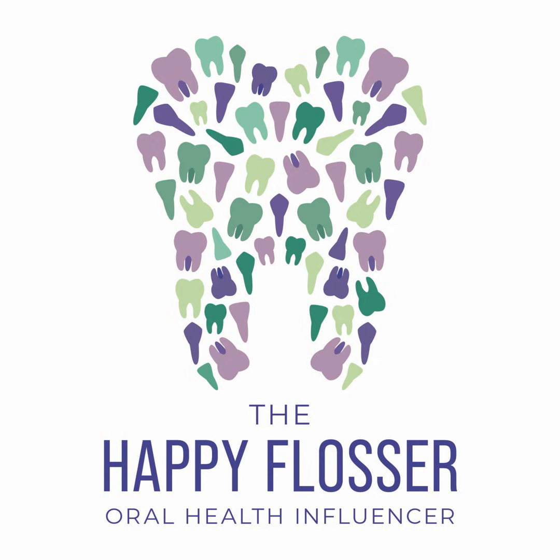So some of the limitations to radiographs is that they don't show mobility, and it is a two-dimensional image of a three-dimensional structure. There are limitations, although we are making lots of progress with our 3D imaging, there's limitations in the information that radiographs provide. It's mostly just evaluating those hard structures. So, for example, you can't see the attached gingiva on a radiographic image.